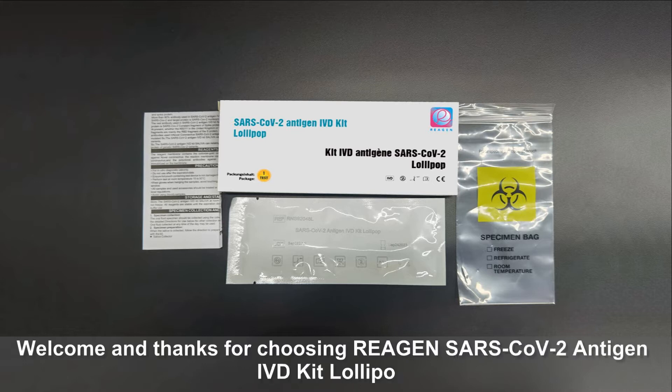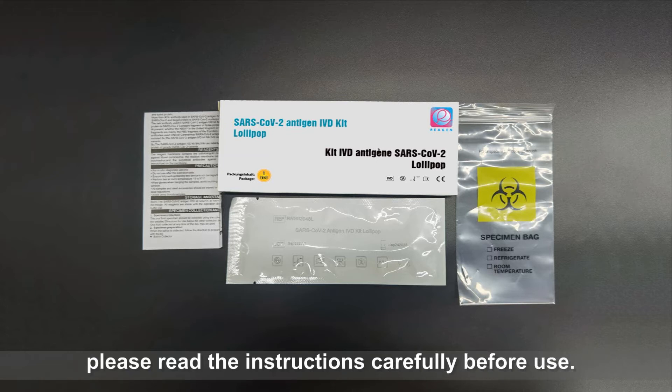Welcome and thanks for choosing REAGEN SARS-CoV-2 Antigen IVD Kit Lollipop. Please read the instructions carefully before use.